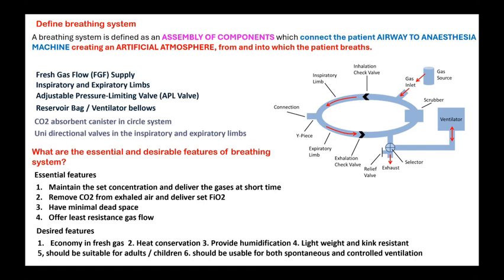cycle of the respiration. And the reservoir bag, what is the purpose of the reservoir bag, Anish? The purpose. What is the volume that you use for adults? What is the volume of reservoir bag you use for pediatric cases? Around half.